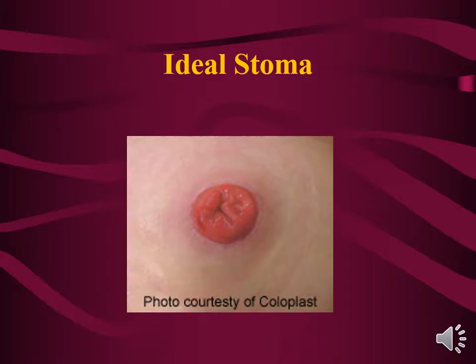Now, one really cool thing that a stoma nurse can do prior to surgery, if it's not an emergency surgery, is mark where the stoma goes, and we have patients lay down, sit up, go forward, and we try to keep that placement out of their abdominal folds so that it can be in the best place to have that flat plane surface so that they can get the best placement for quality of life purposes.